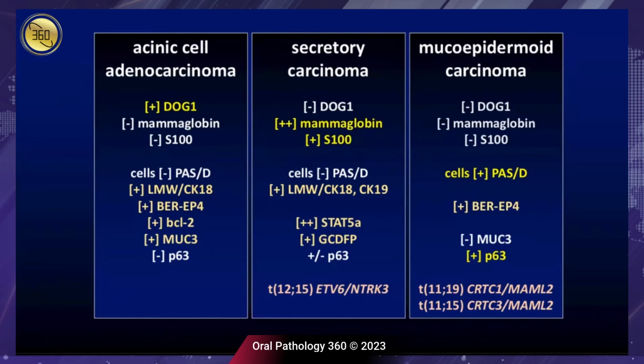And with secretory carcinomas, if you don't have the genetics, because we know there are NTRK mutations associated with secretory carcinomas, almost uniformly these lesions will be positive for mammaglobin and S100. And a strong mammaglobin positivity should lead you there, even without genetics. I've talked to Dr. Sitala about this. I've sent him cases. He says if you have a strong mammaglobin positivity and everything else is negative, you can presumptively say this is going to behave like a secretory carcinoma.